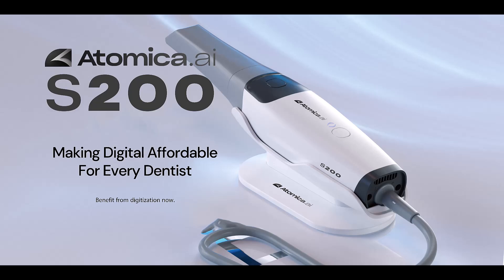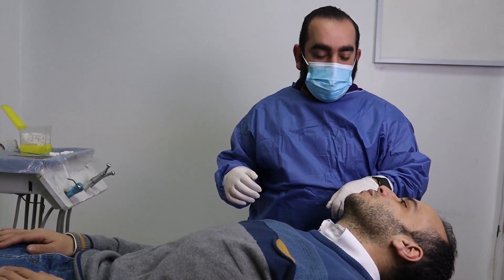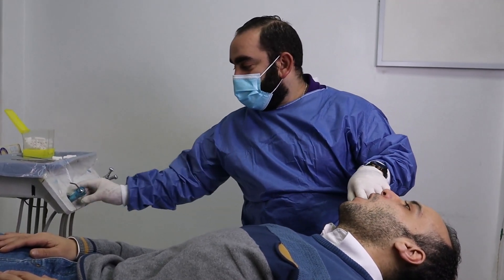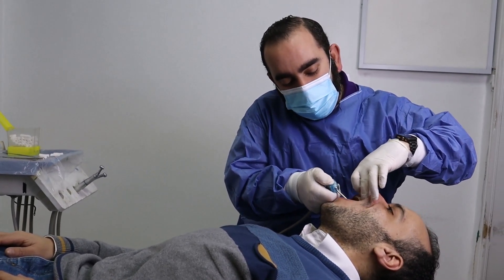Before you start scanning, there are two important points that would highly affect your scan quality. The first one is dryness. Before scanning, make sure that the teeth surface is as dry as possible. This could be achieved using the air water syringe.